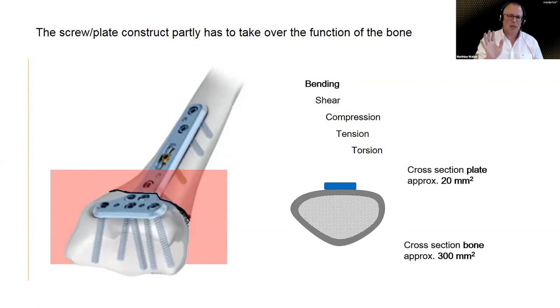And sometimes, you see, this can be a good thing for the mobile tissue, so for all the flexor and extensor tendons that have to run across the metalwork, or it can also mean that the designer designed just a plate that was good for repairing maybe a plastic bone or something, but there was no real attention given that there is also gliding tissue that has to cross the metalwork.